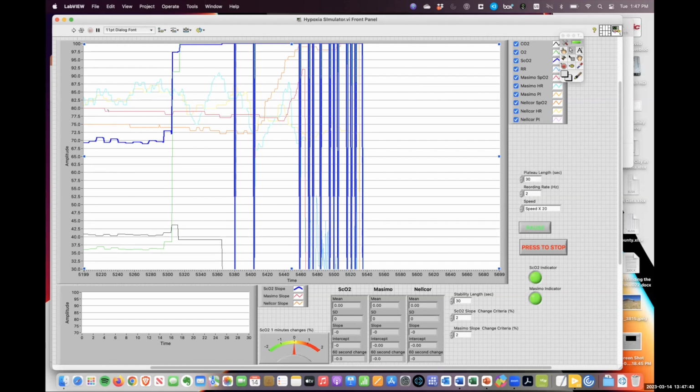And this is in a very controlled setting, so having a simulator, I think, will allow this to be much more useful. And certainly developing it allowed us to display what a real desaturation study looks like for those who haven't witnessed it or those who haven't actually been a study subject.